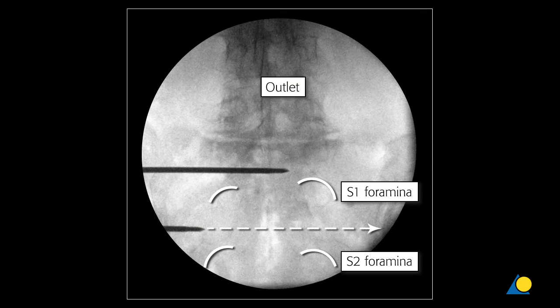The guide wire is positioned into the contralateral side and confirmed on the inlet and outlet views.